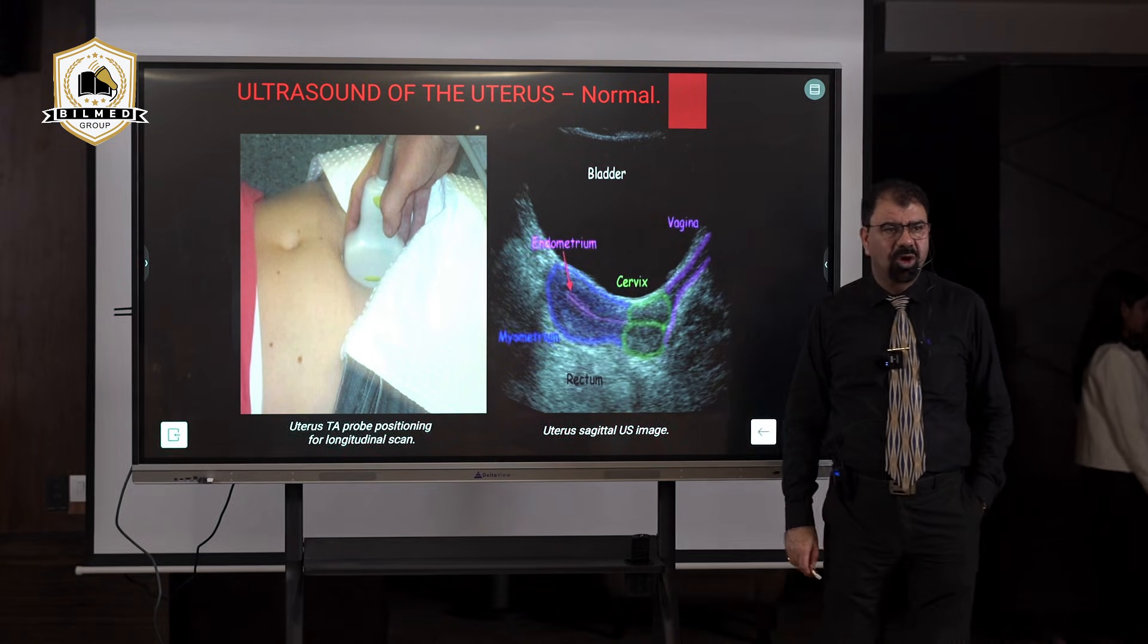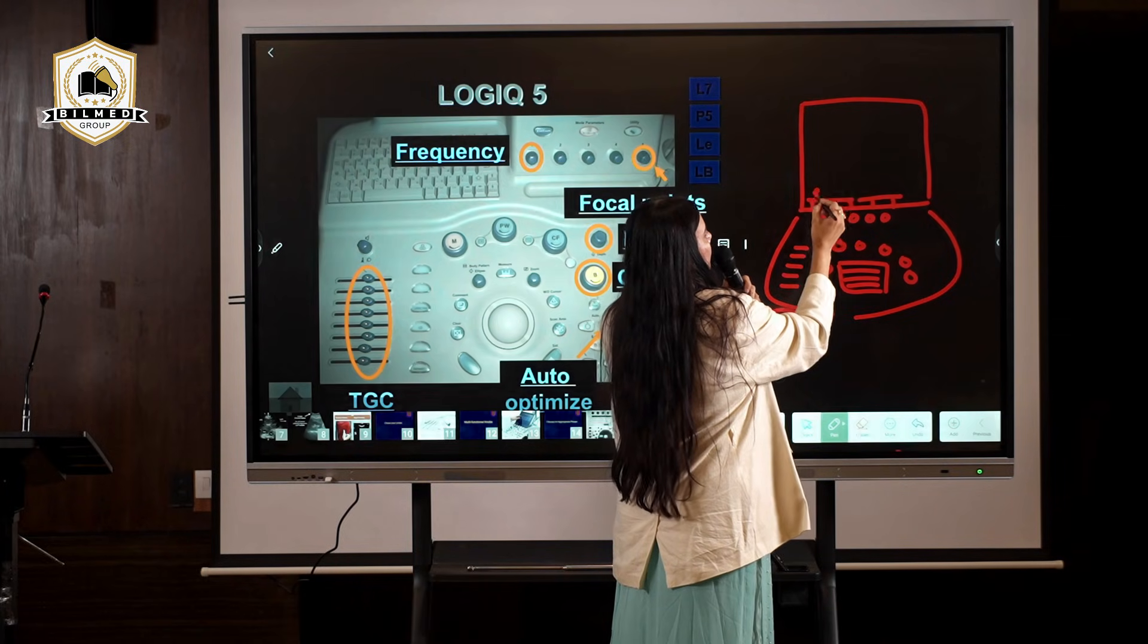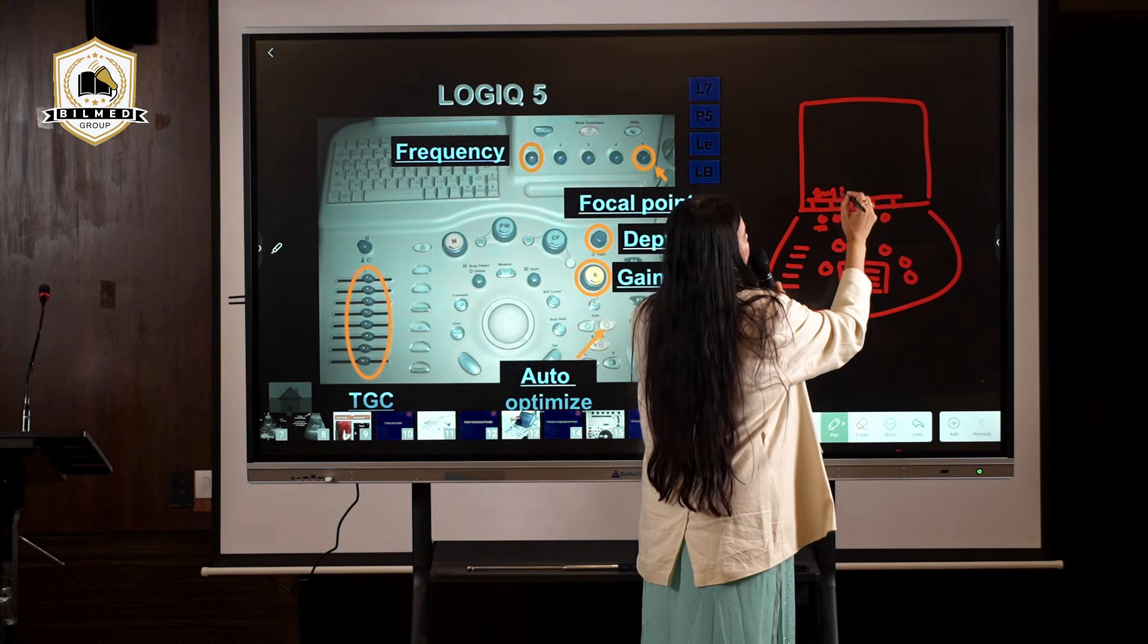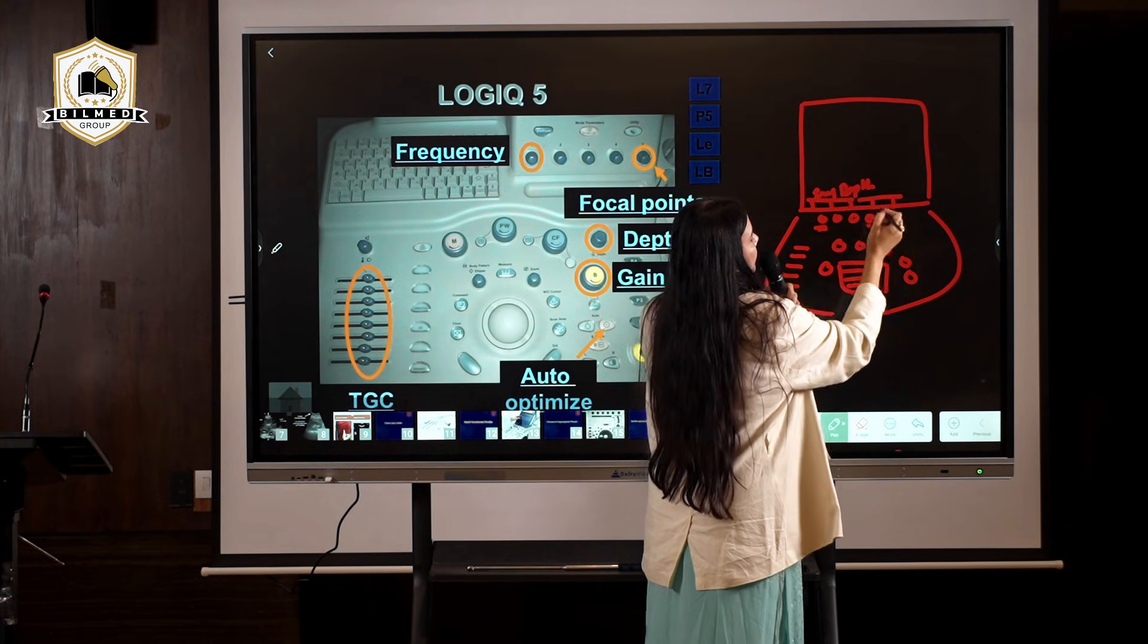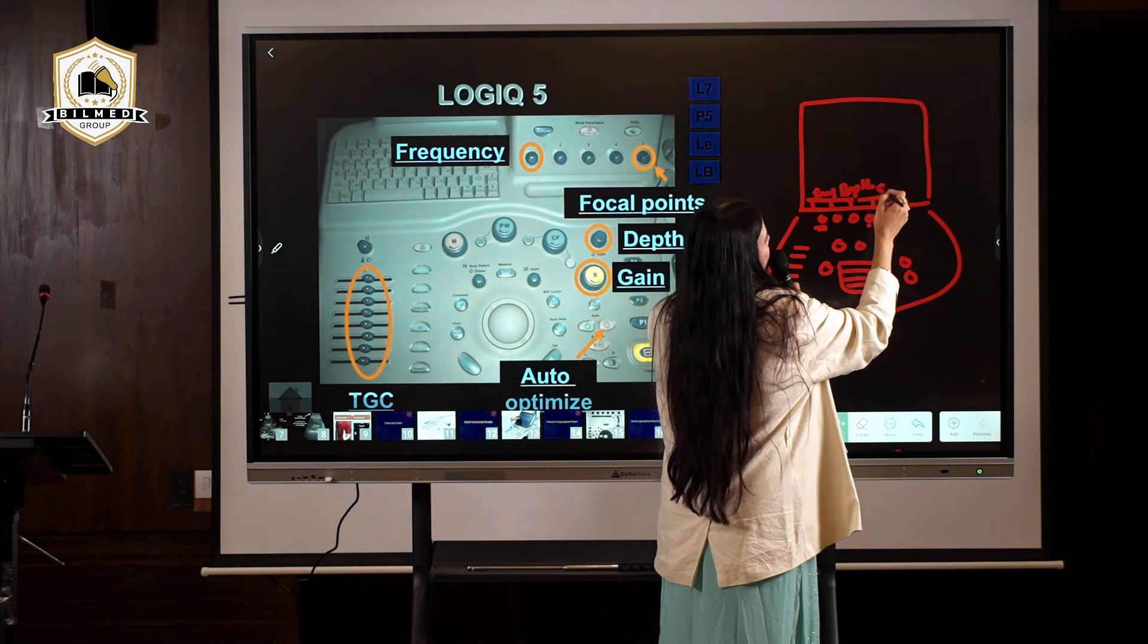Your bladder should not be over-extended and neither it should be empty. This box is going to reflect something like frequency. Then this knob will reflect depth. Here on the dialogue box, this will reflect say gain, or it will reflect focus or something like that which this dialogue box is going to tell you.